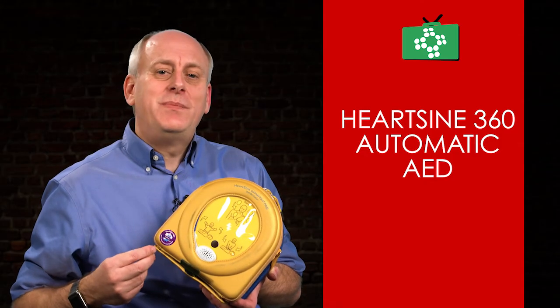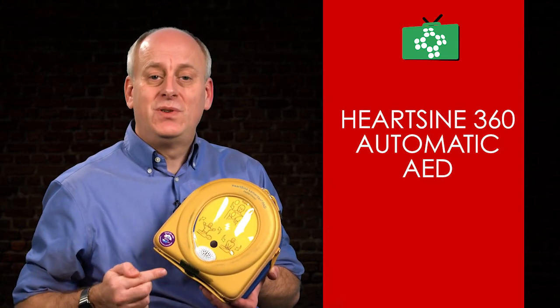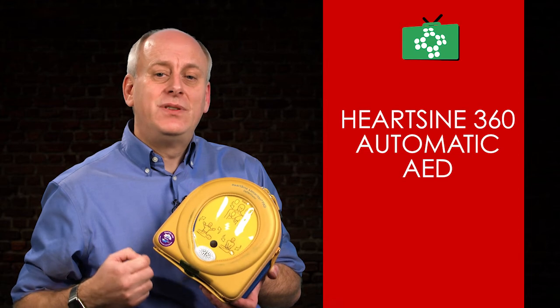In conclusion, the 360p is the same as other HeartSine AED units, the only difference being that you do not need to push the shock button as the shock is delivered automatically.